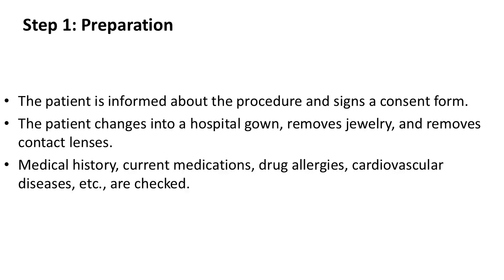Step 1: Preparation. The patient is informed about the procedure and signs a consent form. The patient changes into a hospital gown, removes jewelry, and removes contact lenses. Medical history, current medications, drug allergies, cardiovascular diseases, etc., are checked.